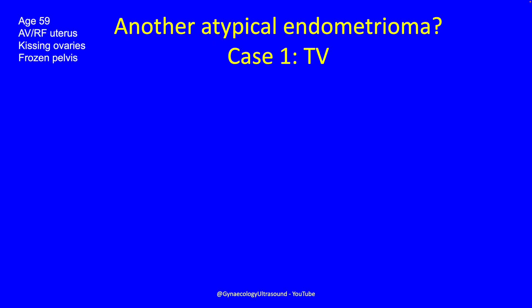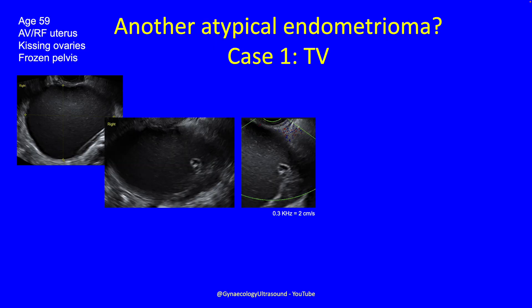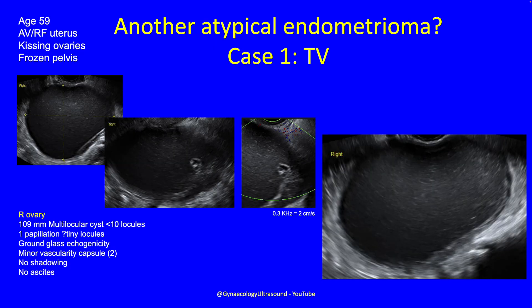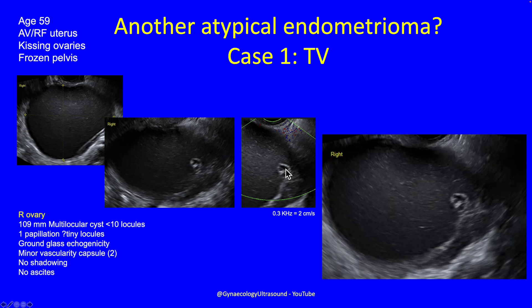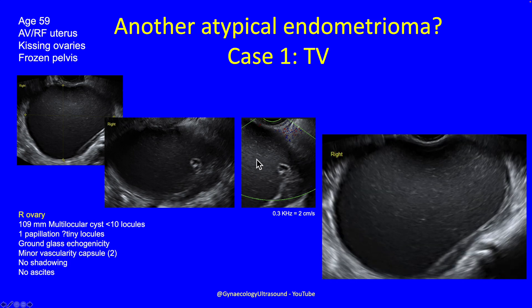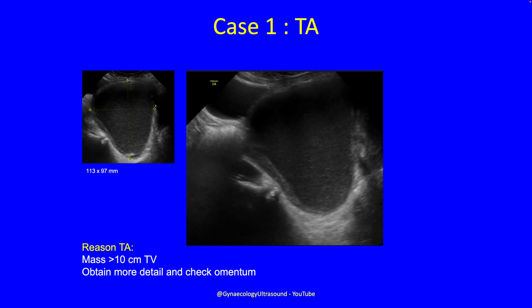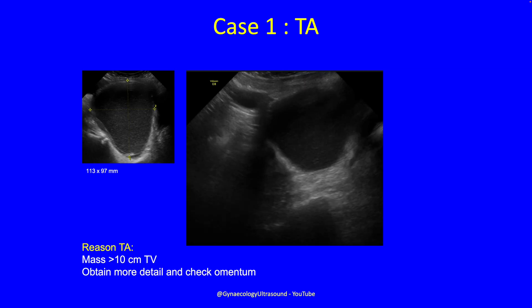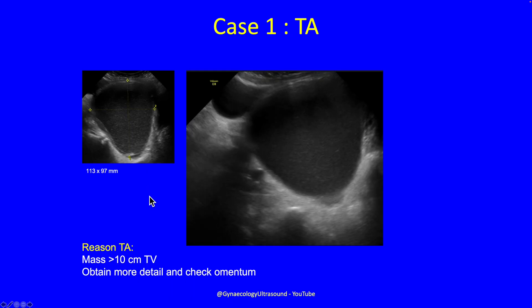Would this be another one? This patient was 59, presenting with an anteverted retroflex uterus, kissing ovaries, and a frozen pelvis. Her cyst was 109 millimetres and multilocular — it's not clear whether these are a few small locules together or a papillation. There's ground-glass echogenicity, minor vascularity in the capsule, no shadowing, and no ascites. We went transabdominal to get better views of the cyst, since it was more than 10 centimetres, and to check the omentum.